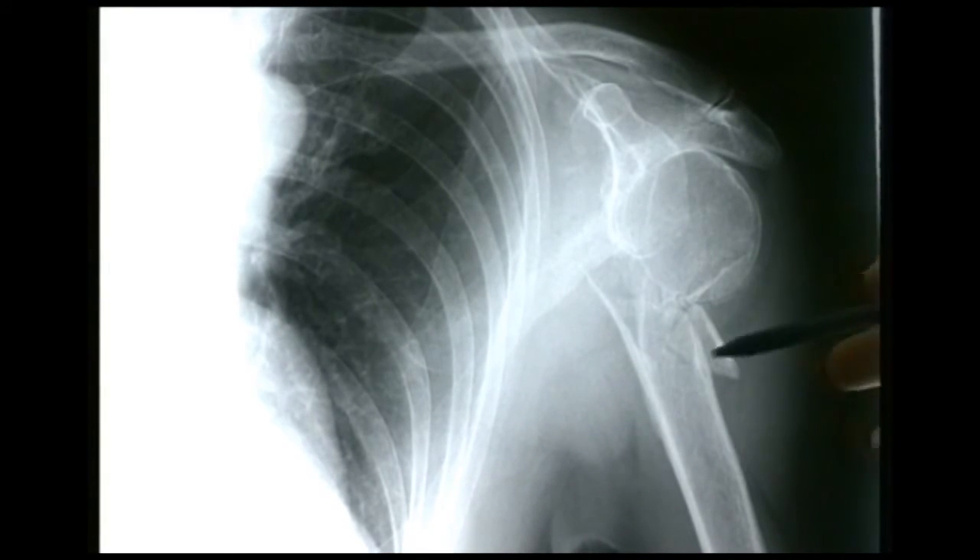Strictly speaking one could classify this as a pathological fracture, although in common description we wouldn't normally say so. The term pathological fracture is more commonly reserved for fractures through tumours, bone cysts, or bone weakened by some other specific method.